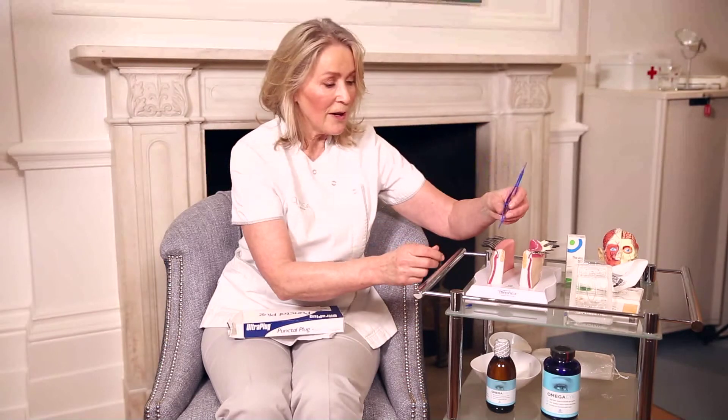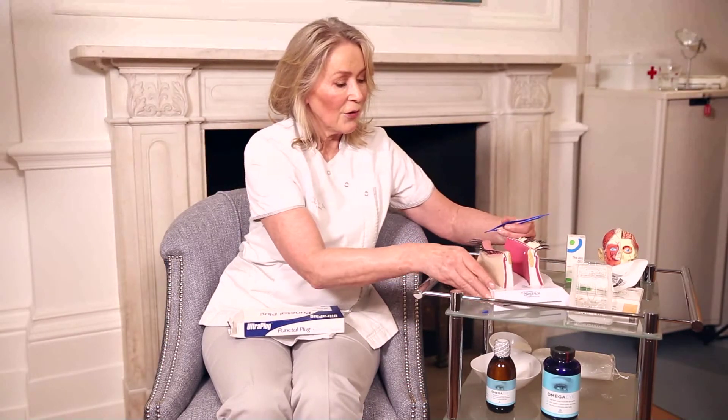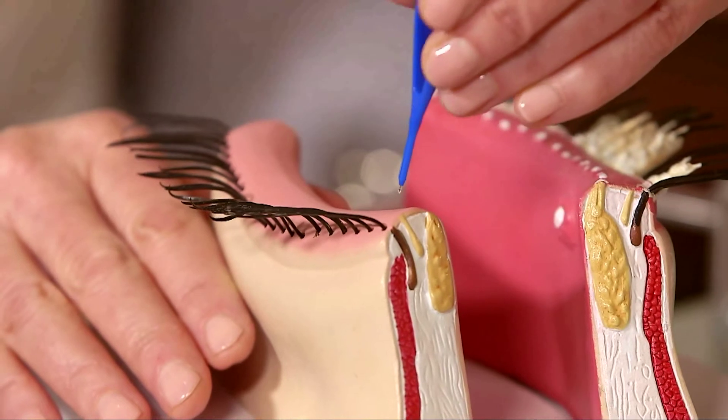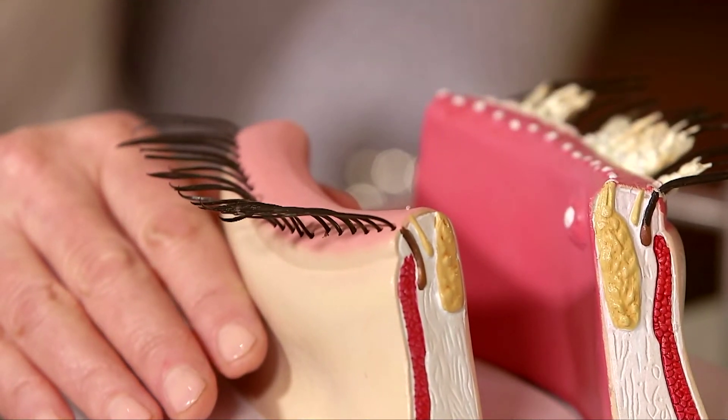This lid's a little bit too big for it, but essentially I've got the lid on stretch like that, pop it in there, and I leave it behind. There's now no plug on the introducer — it's in the lower punctum.